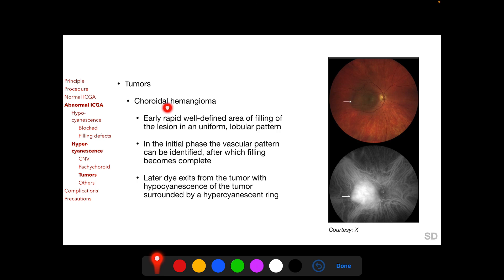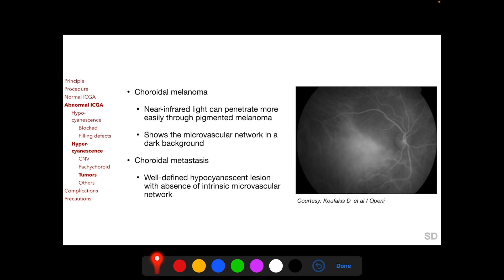In choroidal hemangioma, ICGA in the early phase shows a rapid, well-defined area of filling in a lobular pattern; later this filling becomes complete. Characteristically, ICG dye exits from the tumor in subsequent phases, with hypocyanescence of the tumor surrounded by a hypercyanescent rim. In choroidal melanoma, ICGA can demonstrate the microvascular network in the tumor against a dark background. In patients with choroidal metastasis, a hypocyanescent lesion is seen but with absence of any intrinsic microvascular network.